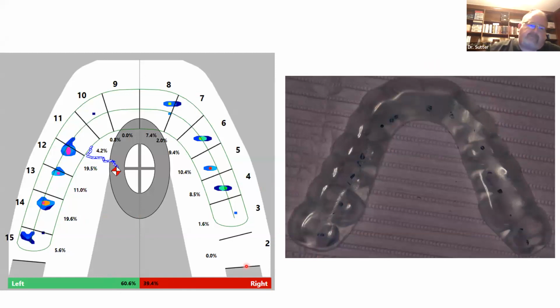And so when a patient sees this on the screen, it's equivalent to seeing the photograph of the broken tooth with the recurrent decay underneath the filling. You don't need to go into some huge lecture like, well, Mrs. Jones, you're looking at a digital occlusal analyzer, and what it's telling us is you're out of balance. Keep it super simple. Mrs. Jones, this is a bite computer and it tells me force distribution and you're off. And these are the two numbers that I'm looking at down here.